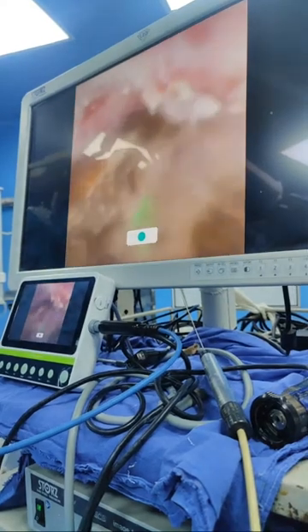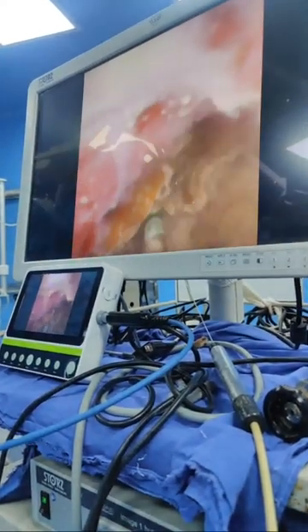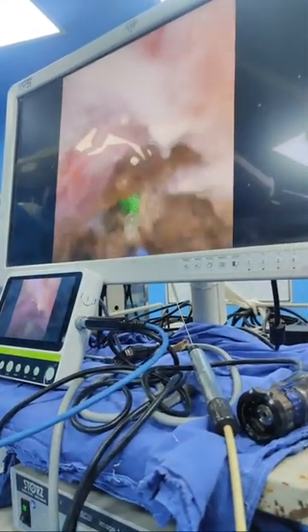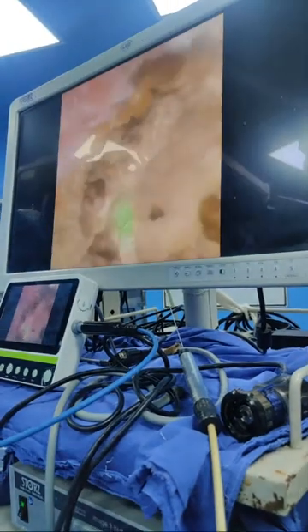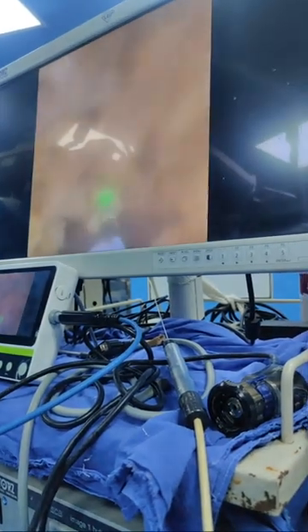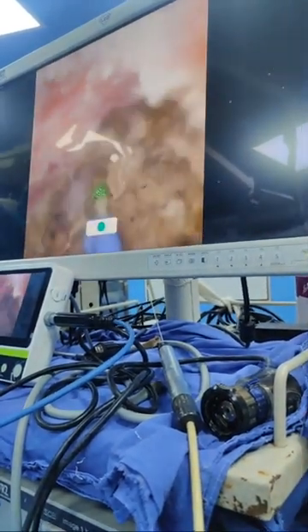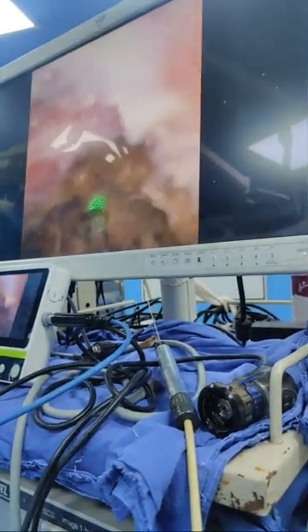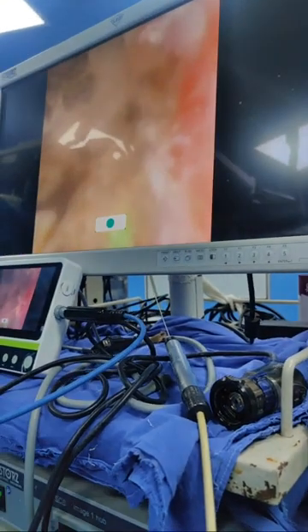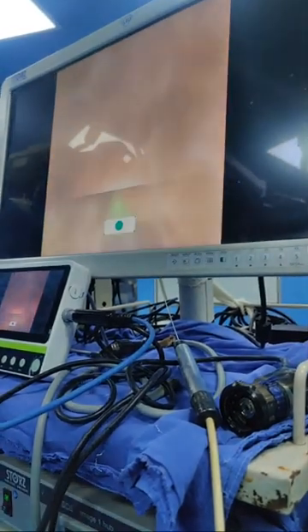Changing the position of your laser fiber by slight movement of your nephroscope, and so the fragmentation strategy is equally important. That would make your job easy or difficult, depending on how you are breaking the stone. The left hand of the surgeon, which is holding the sheath, can work wonders, because if that hand is shifting, you don't have to bother about it.